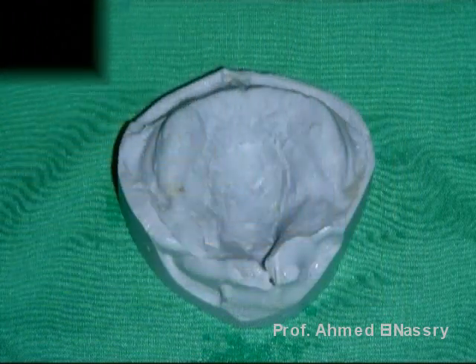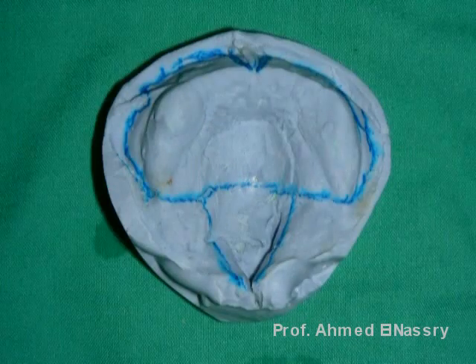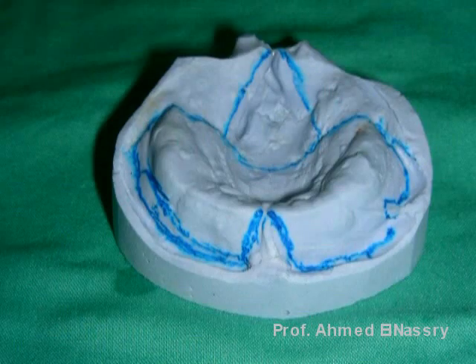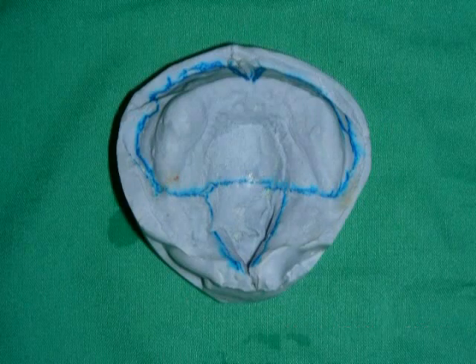Here is the working model on which we are going to construct the feeding obturator. We outline the model and can see that the maxilla is well developed and formed, except for this cleft in the hard palate.